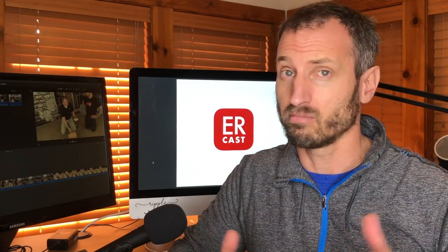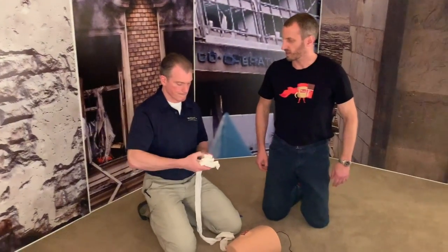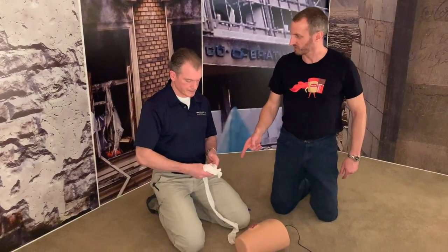Now let's get into what it looks like for a newbie with this technique, and I'll fumble over it a little bit. Don't feel bad if you feel like you're all thumbs on this the first time you do it, because it's not totally intuitive — it definitely takes a little bit of practice. All right, I have never packed a femoral artery or gunshot wound like that. Let's see if I can do it.